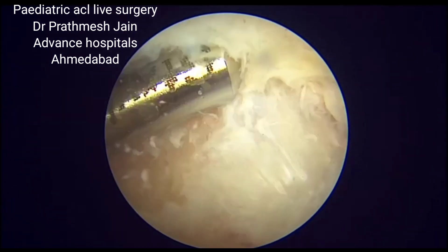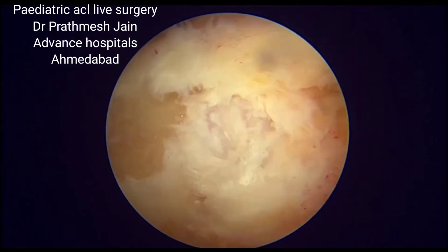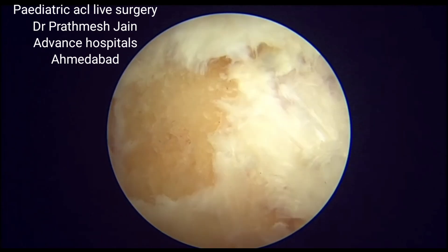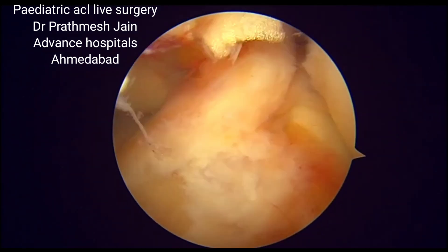The fascia lata graft is harvested from the lateral thigh. We usually take around 15 to 20 centimeters of graft, and that process is detailed on another video.